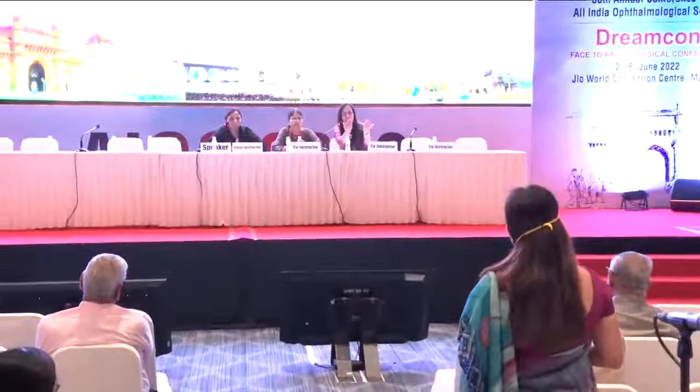So do we get a progression analysis on that also, like in OCT we do? No, in OCT-A, you do not have a software which gives you a progression analysis, so it will be like how we used to hold the fields side by side earlier. But you do have quantitative measurement of angioflow density, so those numbers you can look at and compare. But there's no software which will give you a GPA.